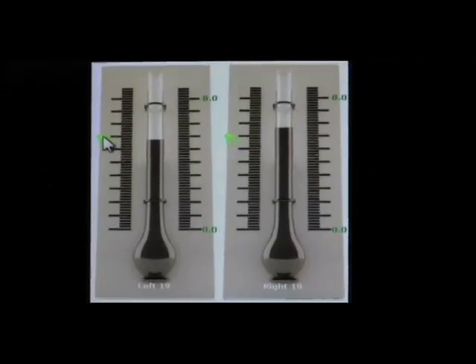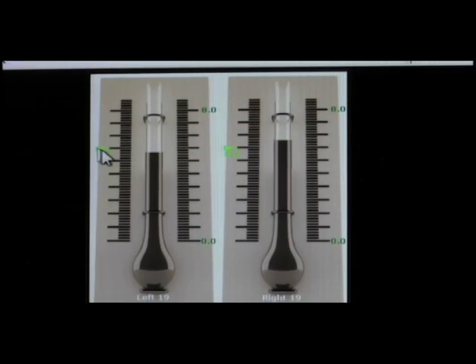I have an auto threshold type of damping threshold following it, so I can see the average values. And we're seeing again that there's slightly higher activity on the right generally than on the left. So that's an example of using the event wizard and the live sLORETA projector to do region of interest training using the event wizard.